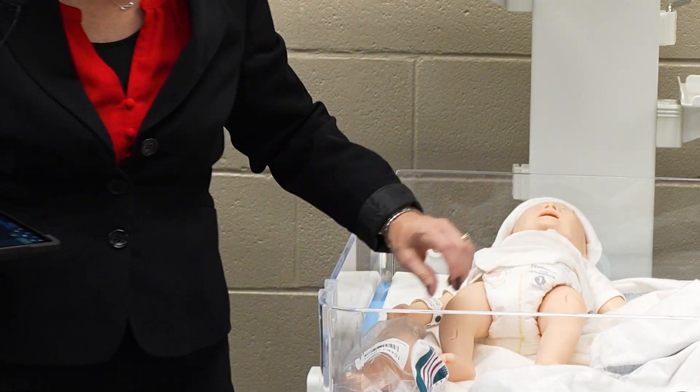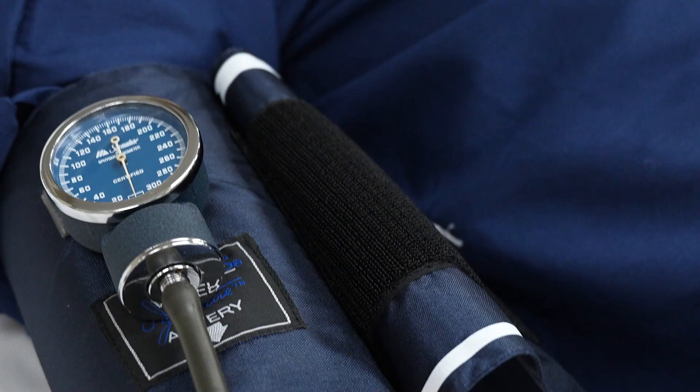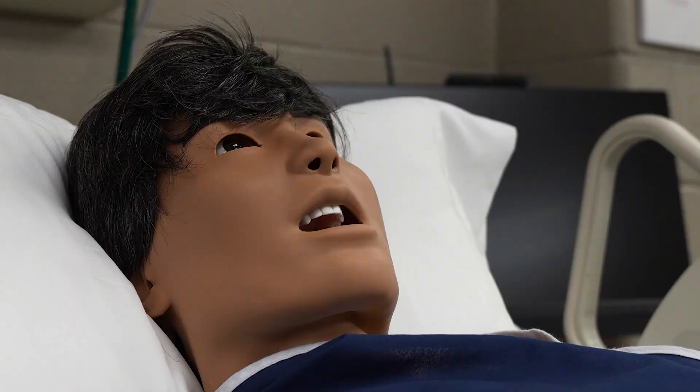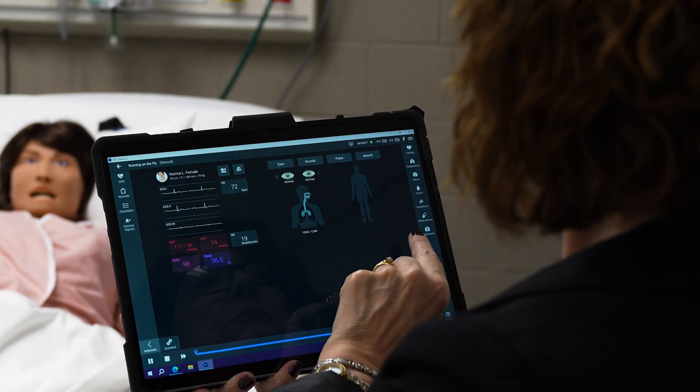Our high-fidelity and medium-fidelity mannequins do more than just allow students to touch and see things they might not see in the hospital or before they reach there. We're able to program them for scenarios, program them for health issues, and change how their heart and lungs, respiratory rate, even their temperature is, so that students can make these assessments. These scenarios are run through our computers and are also recorded, so every session students can watch it back, learn from what they did and what other students did, and we can track their progression all the way through the nursing program from lesser skilled to more skilled.